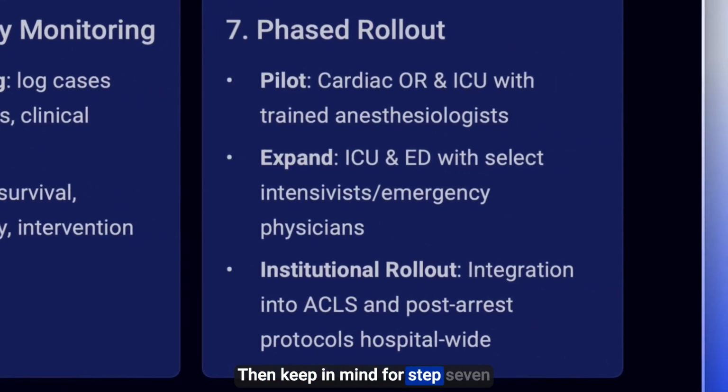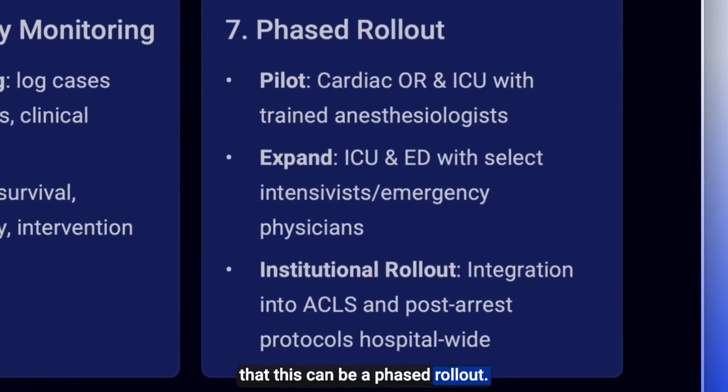Then keep in mind for step 7 that this can be a phased rollout. Remember, you want your highest trained individuals to start doing this first. The cardiac trained anesthesiologists who have the most experience with TEE in the perioperative setting. Then you can expand this to ICU and emergency department settings where select intensivists and emergency physicians can use this if they have the training to do so.